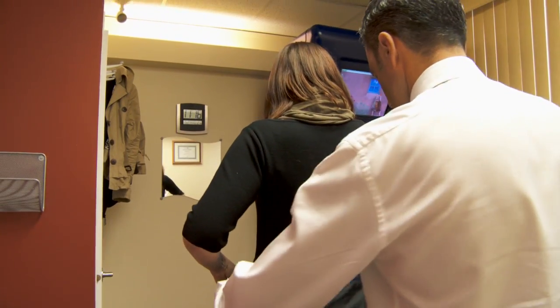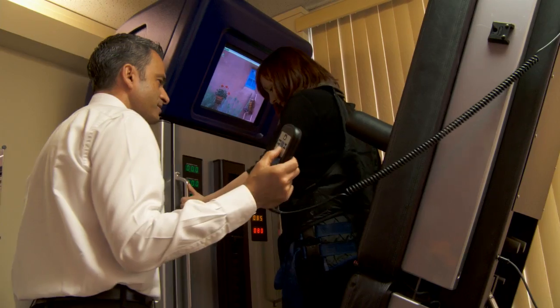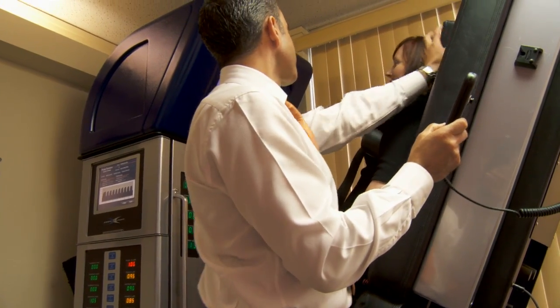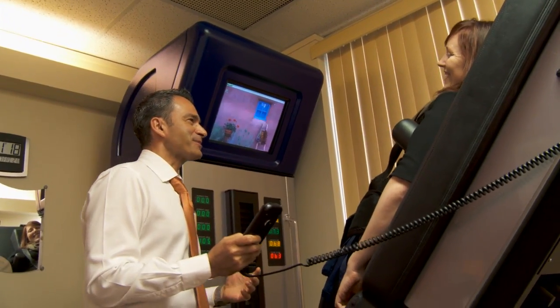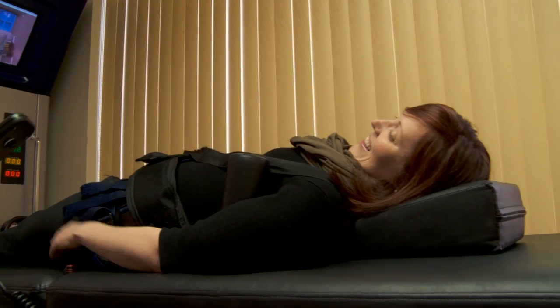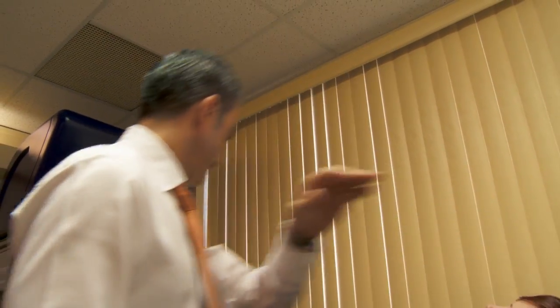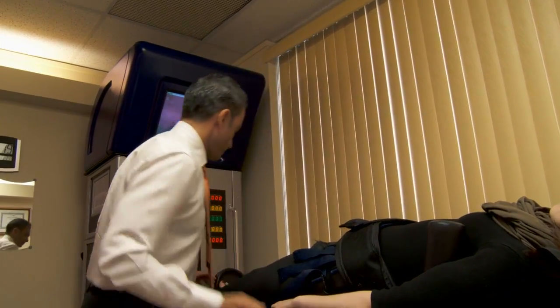It was awful. When a patient is on the decompression unit, the whole purpose of the treatment is to reduce the intradiscal pressure, which is typically increased in a disc condition such as herniation or bulge. So when a patient is in this position, we are targeting one specific disc during the treatment to reduce that pressure inside the disc, and we achieve that by how we position the patient on the table and how we angle and target that disc.